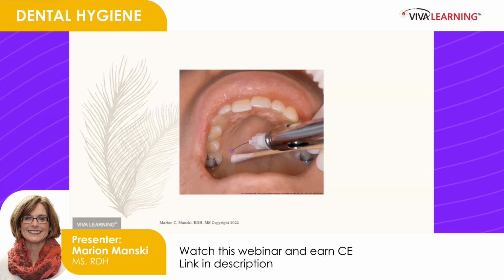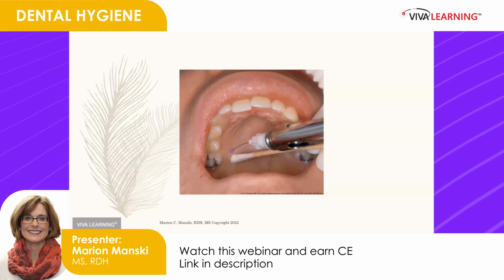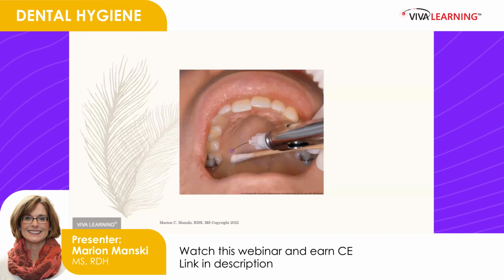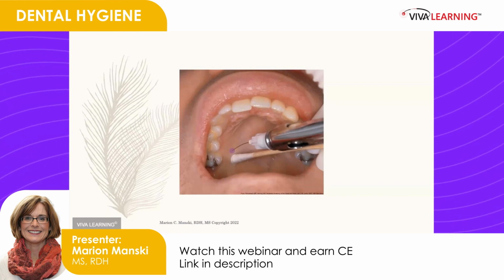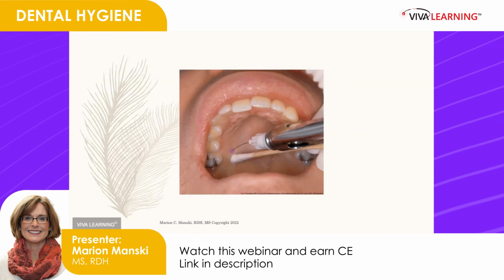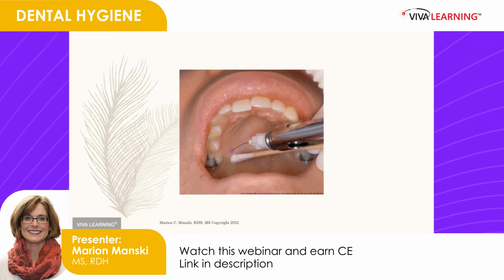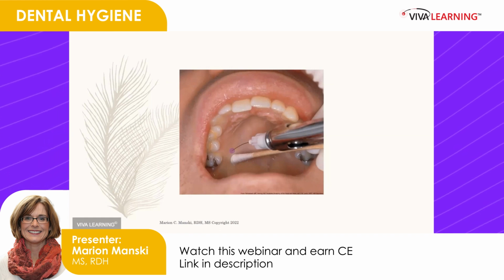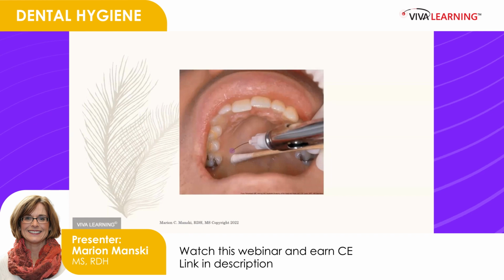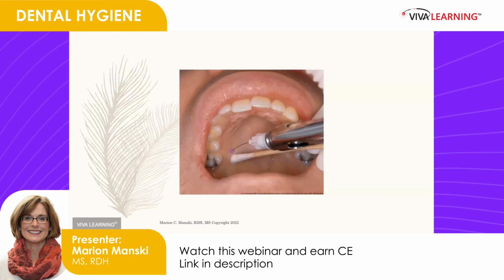And at that 30 seconds, we're going to take that needle and we're going to bow that needle so the bevel's flush against the skin. Now, it's not into tissue yet. It's just flush against the skin. Give a drop, straighten the needle then, and go in and give little drops of anesthetic. When you hit the bone, back up 1 millimeter, aspirate twice. If it's negative, give a quarter cartridge. The whole time that non-dominant hand is pushing on that greater palatine foramen, and that really, really does help.